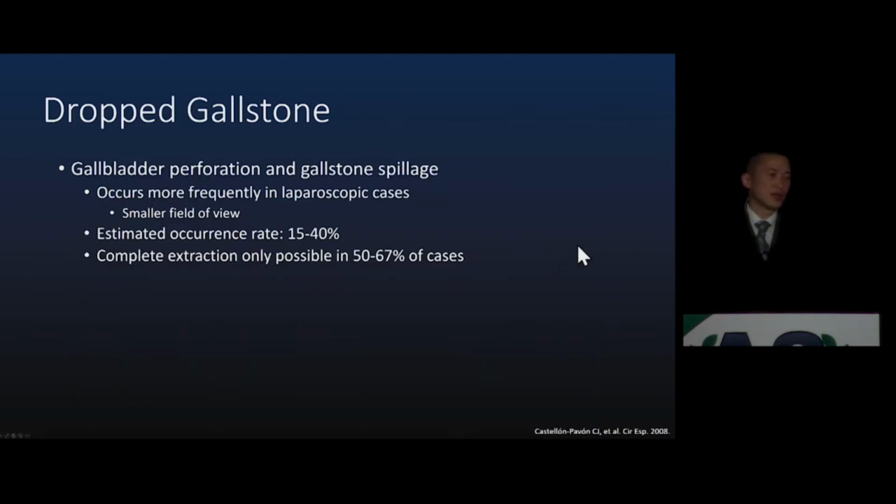Moving on to the next topic, dropped gallstones. These result from injury to the gallbladder and spillage of its contents. It occurs more frequently in laparoscopic cases because of a smaller field of view. It's estimated to occur in 15 to 40% of cases, and in these cases, complete extraction of the gallstones is only possible in 1/2 to 2/3 of cases.